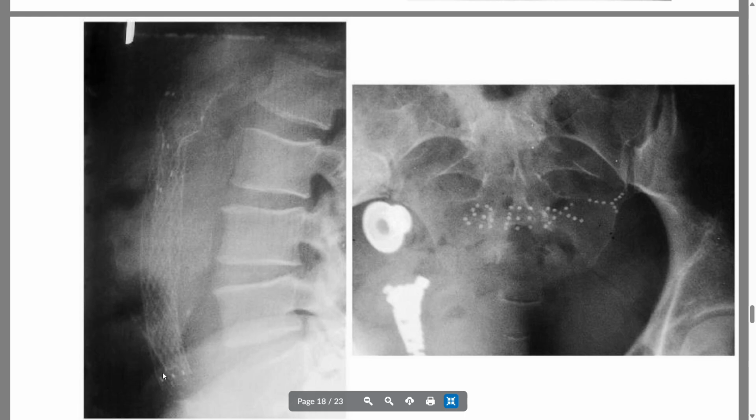But it's essentially a stent that goes in to maintain the shape of the abdominal aorta and its patency, so that those with aortic aneurysms can hopefully maintain the shape and not have them dissect or burst. But you can see this is about what the shape of the aorta should be at this level, and this is the contour of the actual aorta. So they do have a pretty large aneurysm there.